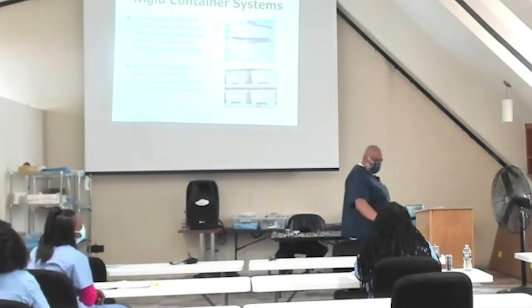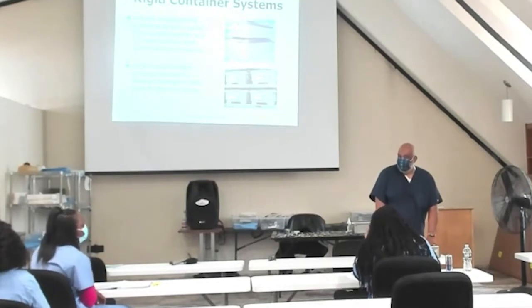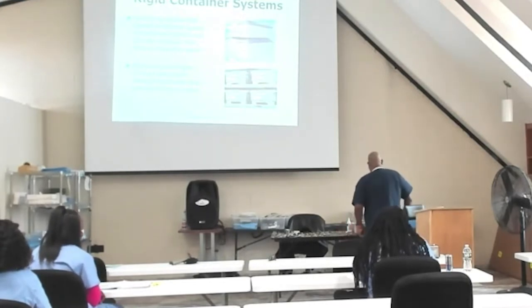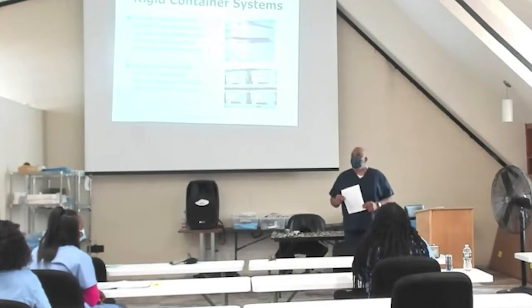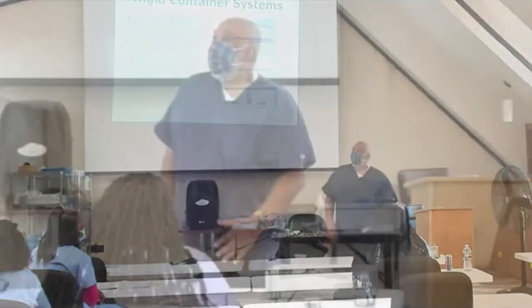So I put the basket in. How do I know what instrument should go in first? The count sheet? Oh, good. I need a count sheet, right? Does everything have a count sheet? I got you. So we got our count sheet. Good. Got my count sheet. What are some of the instruments that are on the count sheet by categories?